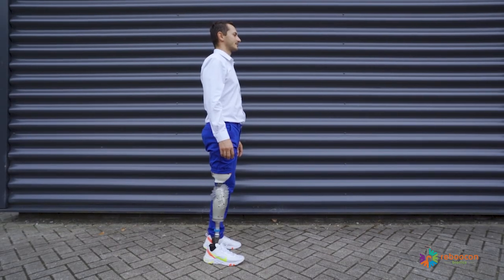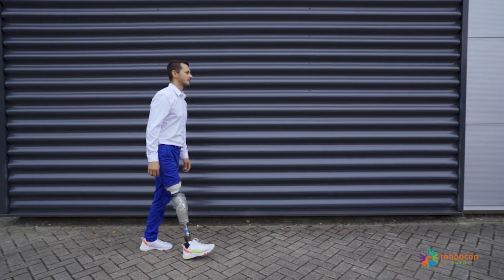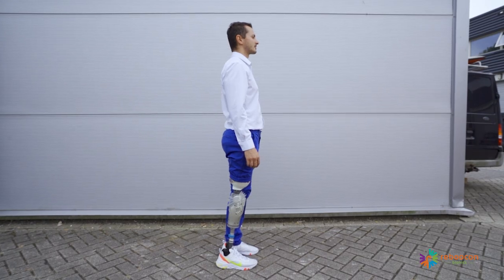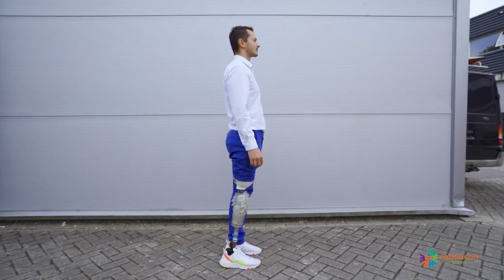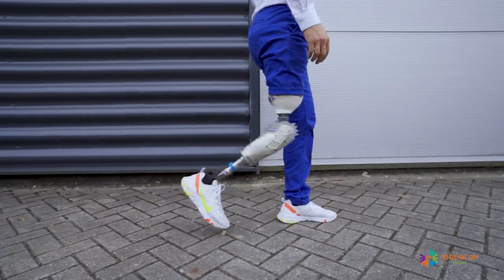Finally, let the user experience the auto-speed-adaptation function. Ask the user to walk fast and slow, and make stops. The prosthesis automatically adjusts to the stepping frequency and stride of the user.